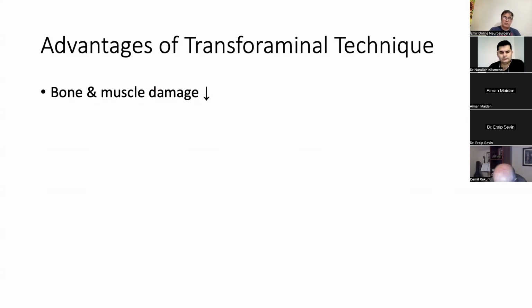The first of these is that the transforaminal procedure is truly minimally invasive. A single endoscopic working portal can provide excellent muscle preservation. In blood profile and MRI findings, Choi revealed that paraspinal muscle injuries from uniportal surgery were fewer than those from biportal surgery.